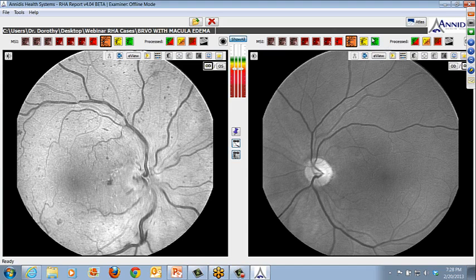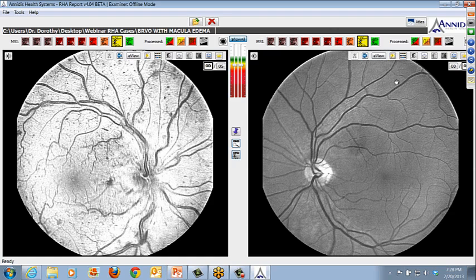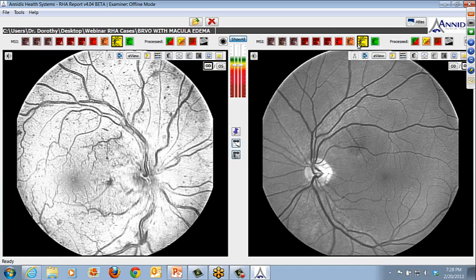If you go into the upper layers, into the greens and the yellows here, if there was significant arteriolar sclerosis, you would actually see some hyaline reflection on the arterioles, which is a secondary indication that there's atherosclerotic disease, in addition to some of the other clinical findings you would see there.